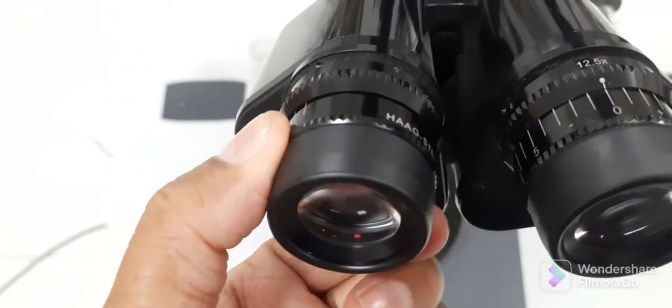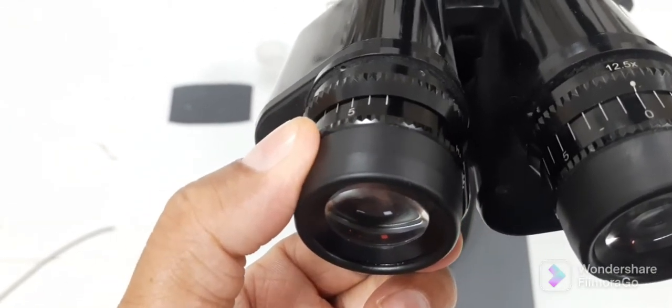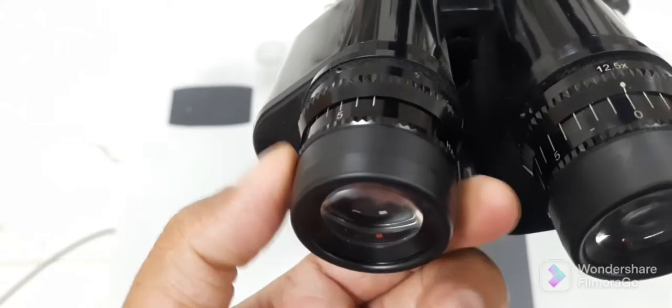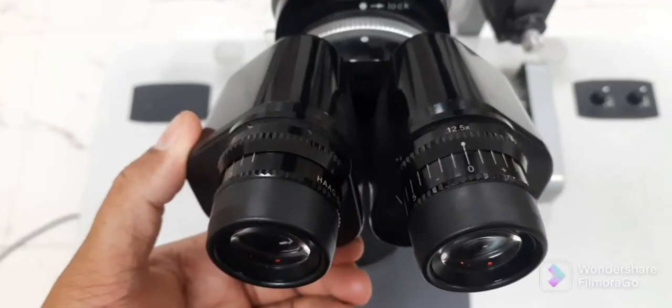So in this way both eyepieces can be focused for proper precise examination of patient's eye.